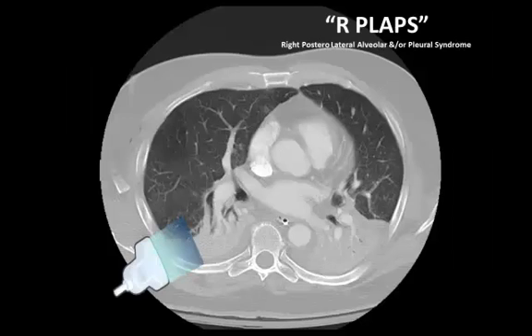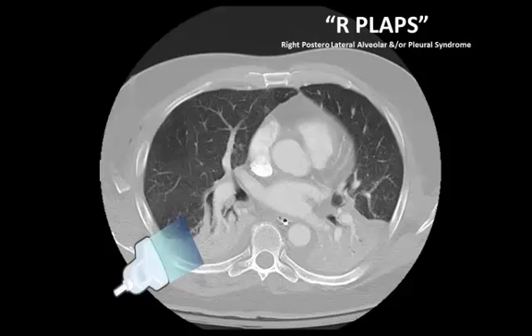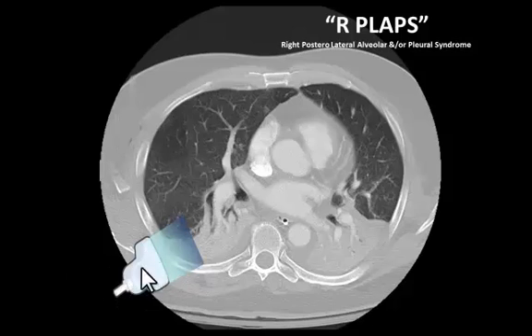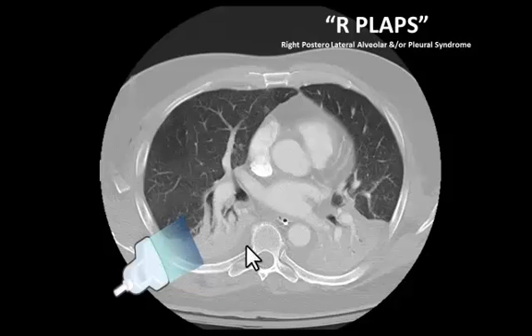Lastly, the PLAPS point. PLAPS, coined by Professor Lichtenstein himself, stands for posterolateral alveolar and/or pleural syndrome location — effectively a long-winded way of saying you're going to find lots of pathology in this view if you can generate it. In supine ICU patients, it can be a challenge to get your probe all the way back here, effectively almost at the margin of where the latissimus dorsi inserts. Sometimes you have to roll your patients or dig very deep into the mattress. As you can see on the CT reconstruct, this is really where a lot of pathology lies.